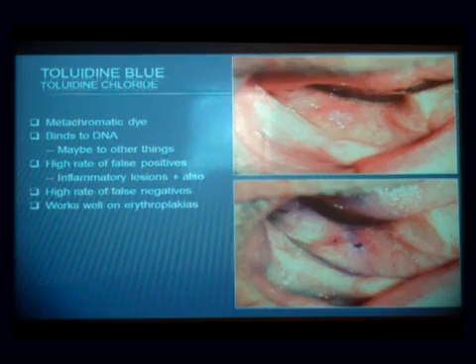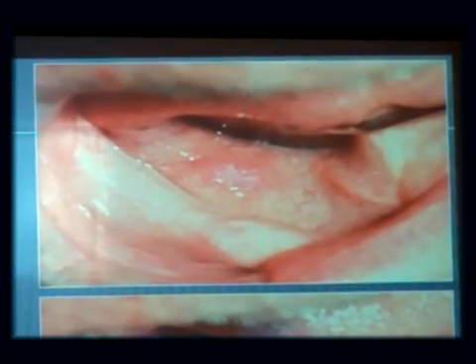They work because the nuclei in dysplastic epithelium are large, there's more DNA in them, they may be twice as large as normal. And even if they're not very large, they're darker because there's more DNA. And this stuff stains the DNA. So it makes sense. Let's put it in the mouth where we see a little bit of irregularity and see if anything sticks, because that is actually staining your patient while the patient is alive. Instead of biopsying it, sending it to my lab, and having me process it in the lab, you're doing it in your office. This was the very beginning of that in vivo kind of lab work that I mentioned.